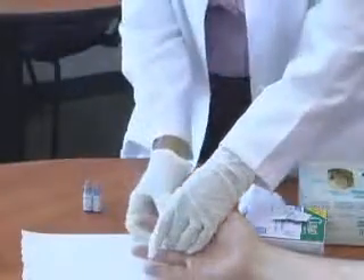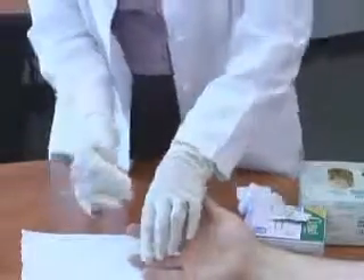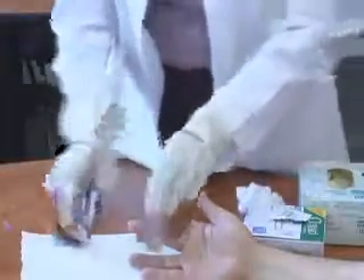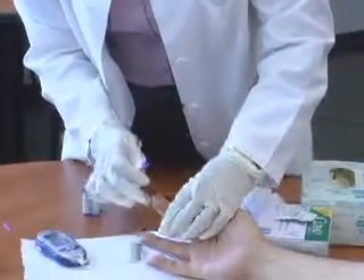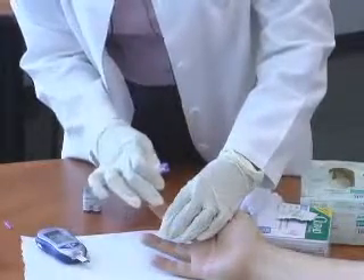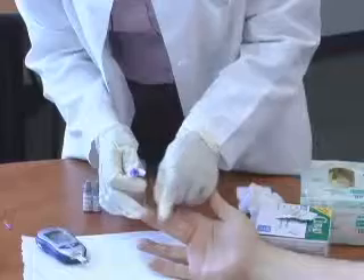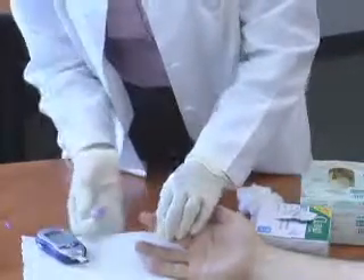At this point, I take the patient's finger and rub it. One thing I notice is that this patient's fingers are soft — I can tell he doesn't do a lot of hard labor — so it's going to be pretty easy to get blood. Where you want to prick on the finger is on the side, on the tip of the finger but on the side. Never in the very center pad of the finger, because that's where all the nerves are and it would really hurt. You prick on the side because that's where it's going to hurt less.